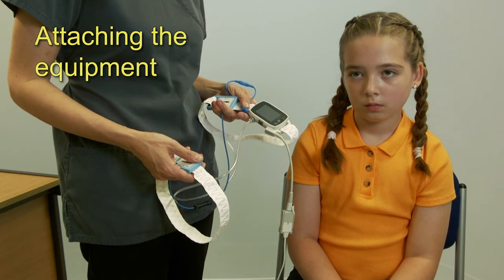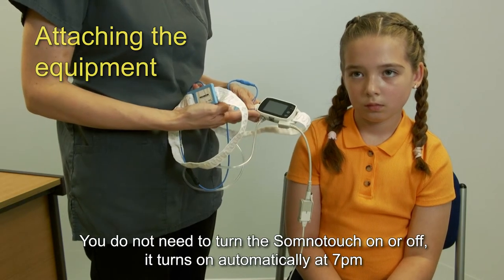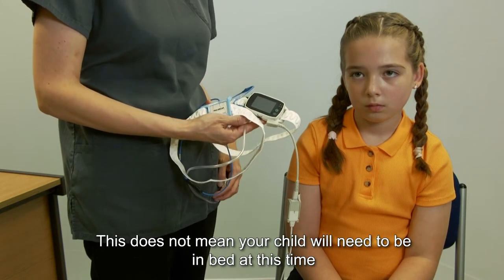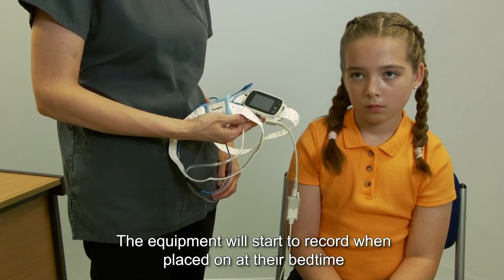When attaching the equipment, you do not need to turn on the SomnoTouch — it turns on automatically at 7pm. This does not mean that your child will need to be in bed at this time. The equipment will start to record when placed on at their bedtime.